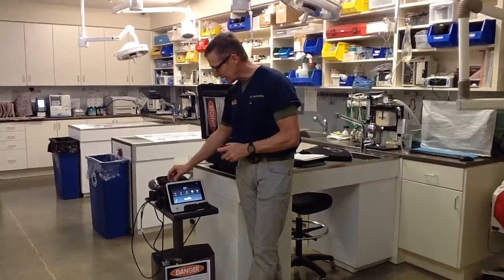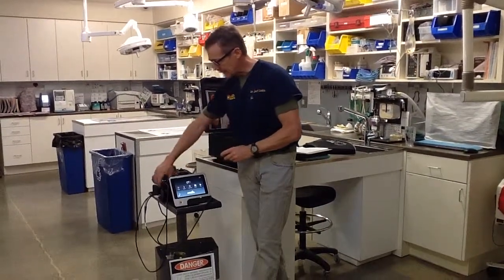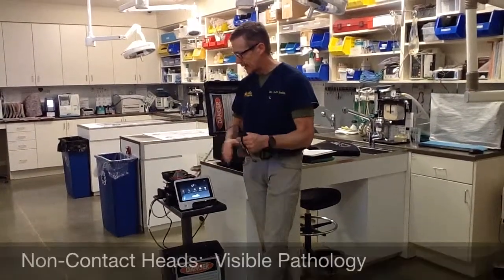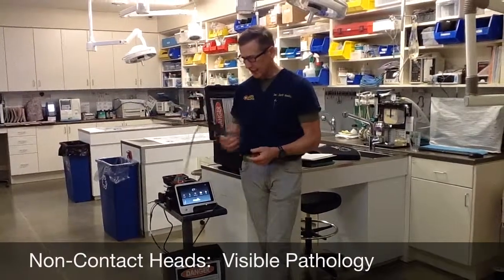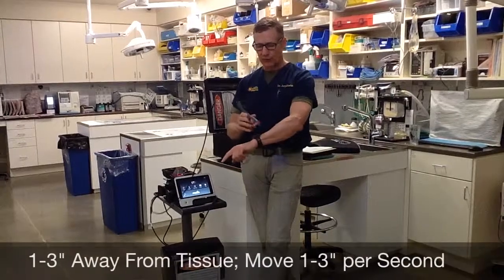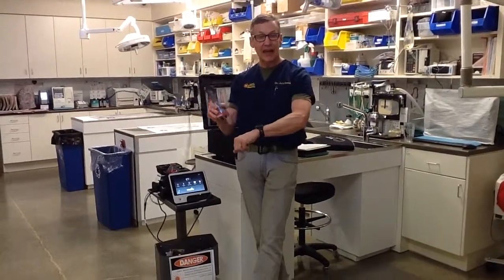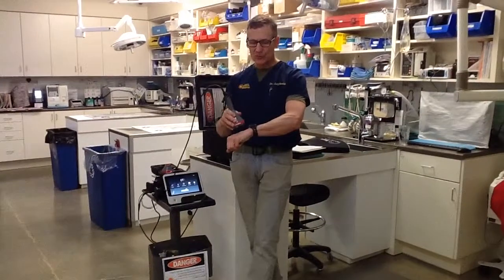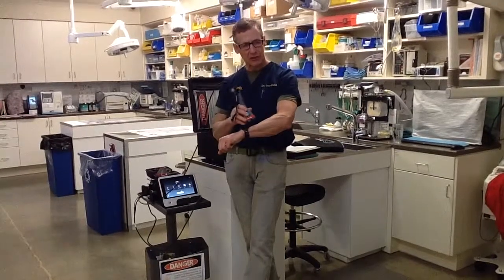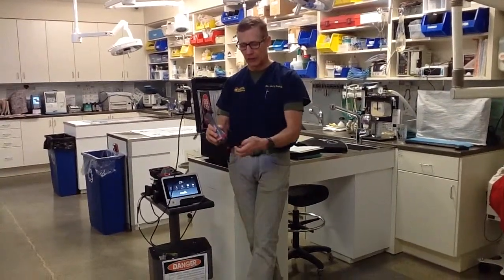We also have the non-contact heads, and those heads are intended for pathology that you can see — stomatitis, gingivitis, otitis, dermatitis. You stay one to three inches away from the tissue and move it at one to three inches per second, but do not contact the tissue with the non-contact head. One inch is better than three inches, and one inch per second is better than three inches per second. It just depends on the comfort level of the animal.